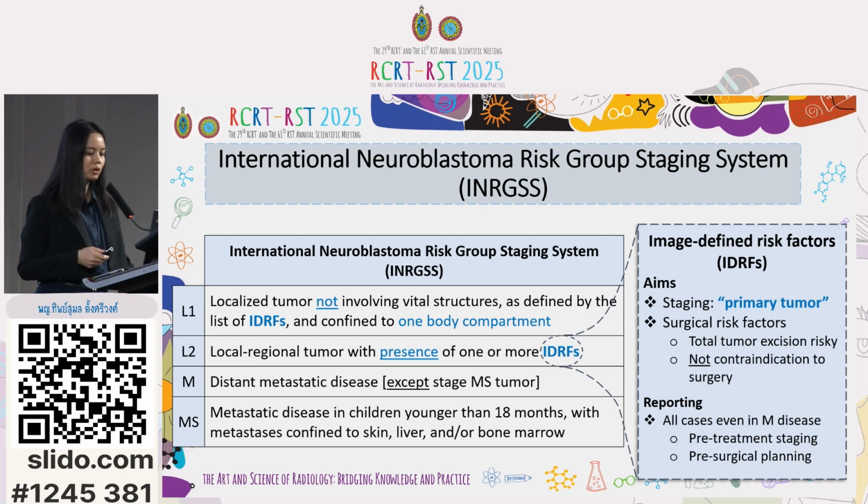IDRFs are used only for staging primary tumor and indicate potential risk of surgical complications due to involvement of critical structures. However, they are not a contraindication to surgery. Clear reporting is essential for helping the surgeons assess potential risk and determine whether complete tumor removal is possible, even in stage M disease. We recommend reporting for pre-treatment staging and pre-surgical planning at a minimum.